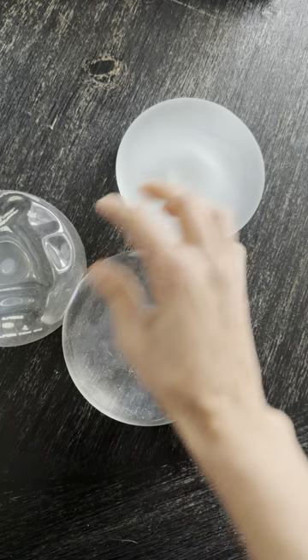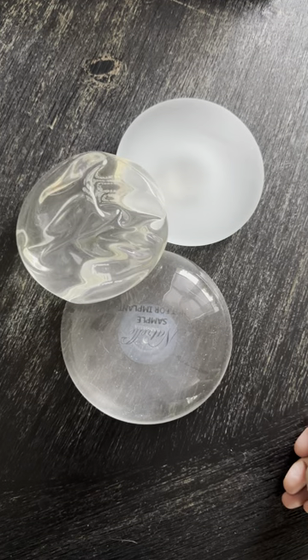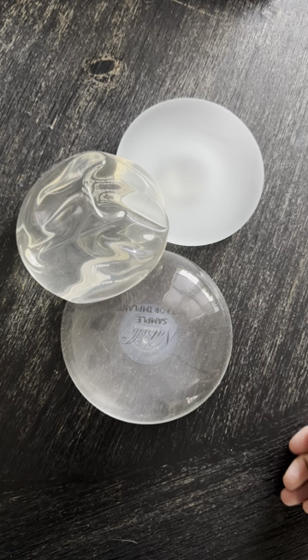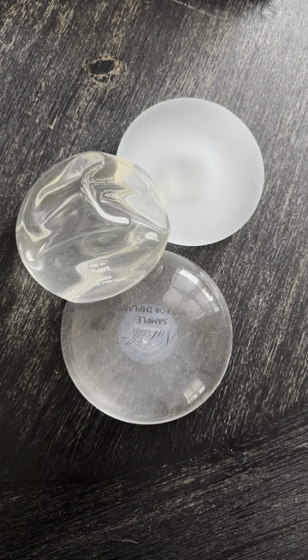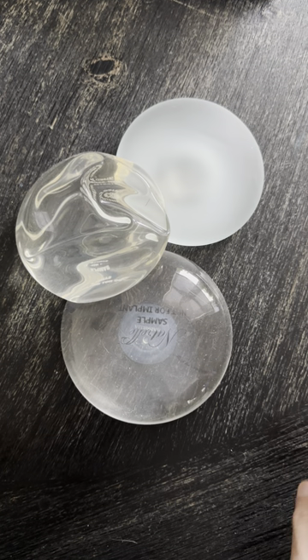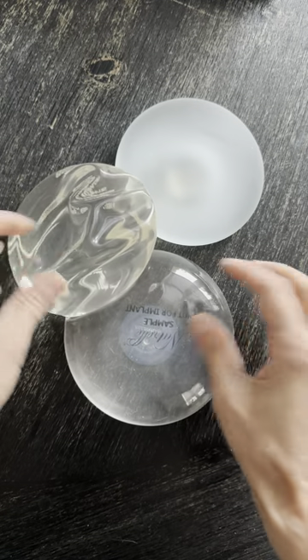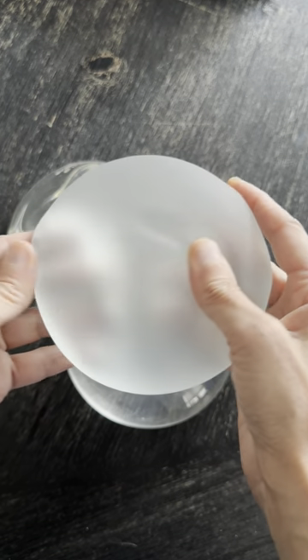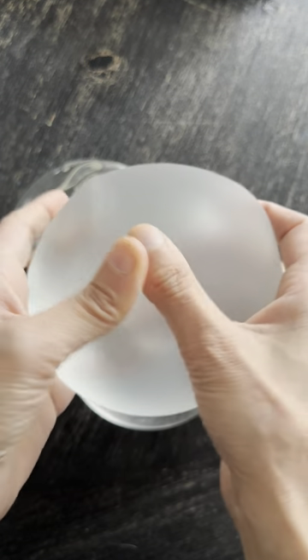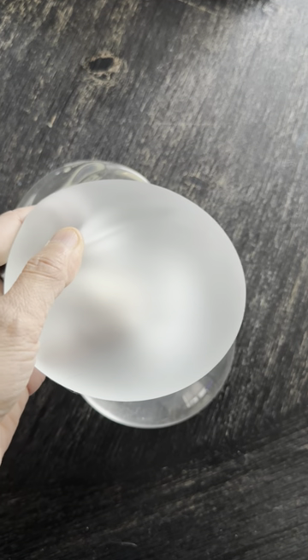I don't have a Mentor implant here — I just don't use them so I don't have any samples in my office — but it's going to be very similar to these two. The Mentor implant in personal use is a bit softer, but I don't use it because I find it also has a slightly higher rupture rate. Now, all three are silicone implants. You'll notice the Motiva implant is a bit more opaque, and that's because it has a different type of surface.